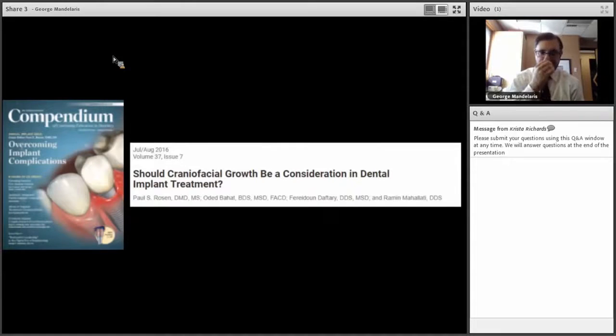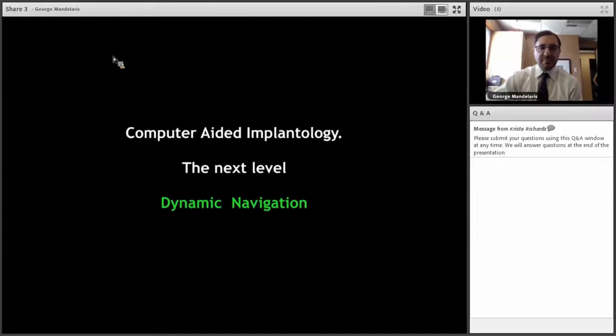So today it's really more important that we have our implants in the cingulum for retrievability and screw-retained access. I think that's where the profession is going, and that's what all of us here tonight strive for. But perhaps even more important is that implants are being placed routinely in young patients, patients in their 20s, and we're telling them these fixtures will last for decades. There is an effect of craniofacial growth that needs to be considered from a retrievability standpoint. If there is some growth, the fixtures or the prosthetics will have to be replaced at some point, and these considerations need to be underscored at the development of a treatment plan. So it's even more important to have this prosthetically directed plan well-centered and well-executed throughout treatment, and to have the fixtures in a retrievable position for the future. Certainly, the younger the patient, the more important that is.